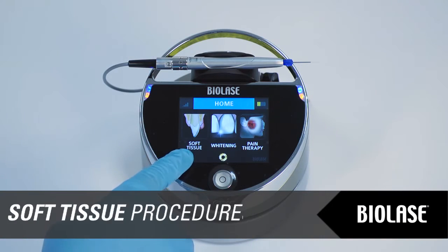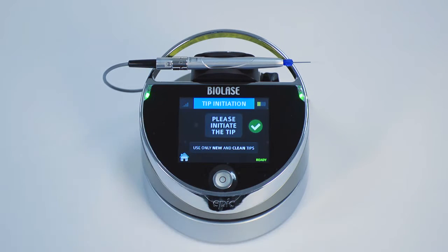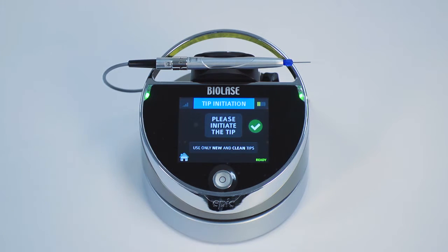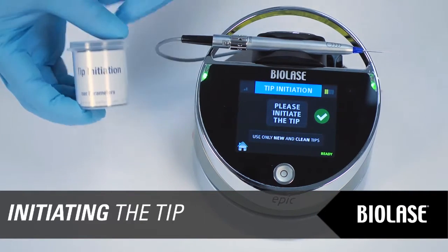Epic has numerous preset soft tissue settings available from the touchscreen interface. Select the procedure you wish to perform by scrolling through the list and tapping the desired procedure. Most soft tissue surgical procedures require initiation of the fiber tip. Epic will prompt you if initiation is recommended. If Epic prompts you to initiate the tip, follow these steps and settings.